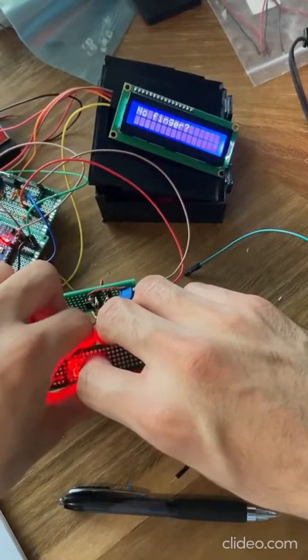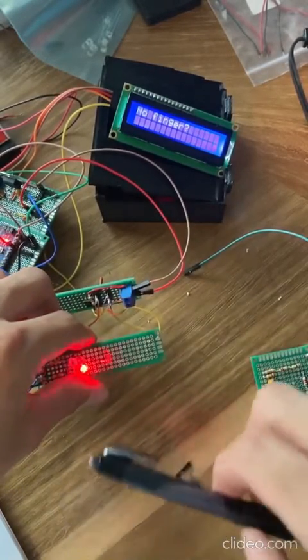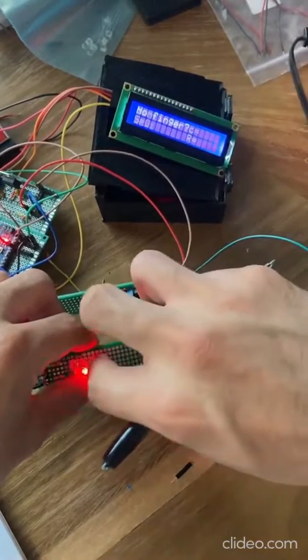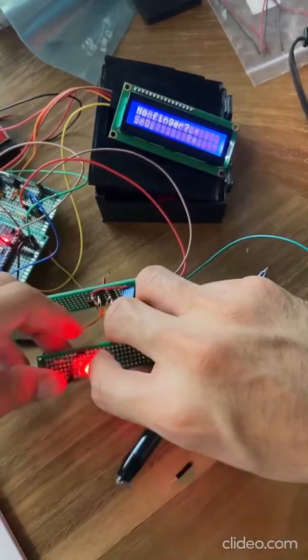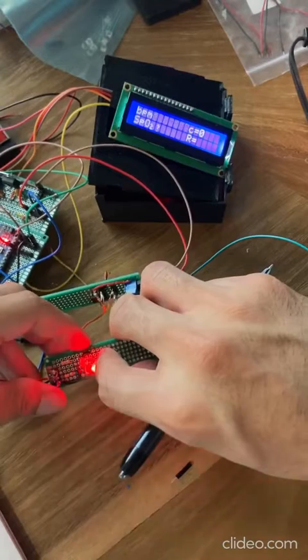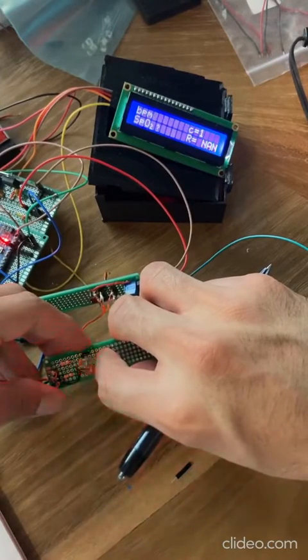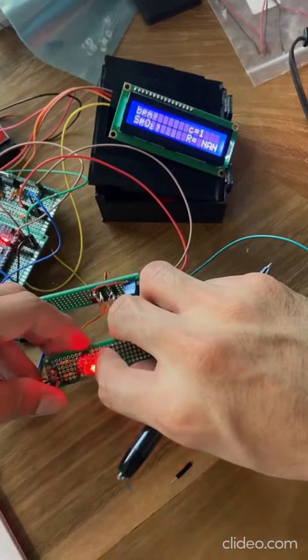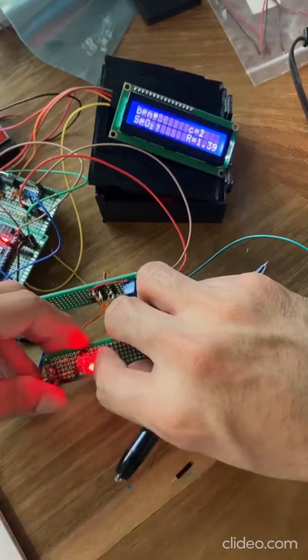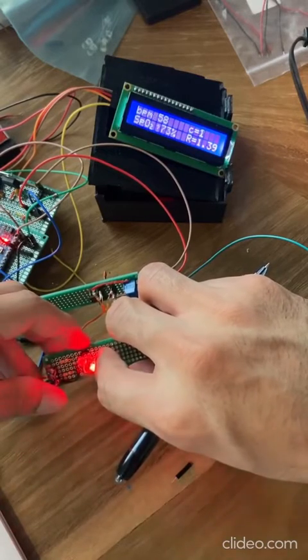So after the signal is read, what should happen after I put my finger in there, and you kind of see how it flickers off and on, BPM will appear on the screen, as you can see now. Right now it's taking the signal and taking averages. You can kind of see the heart popping up where the BPM is at. The R ratio will pop up, and so will the C constant. As soon as there's enough, there it is.